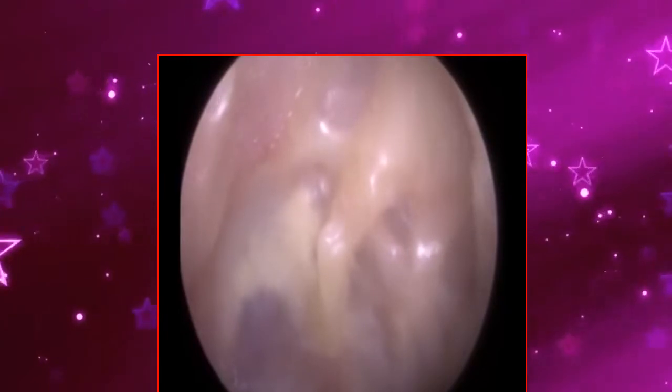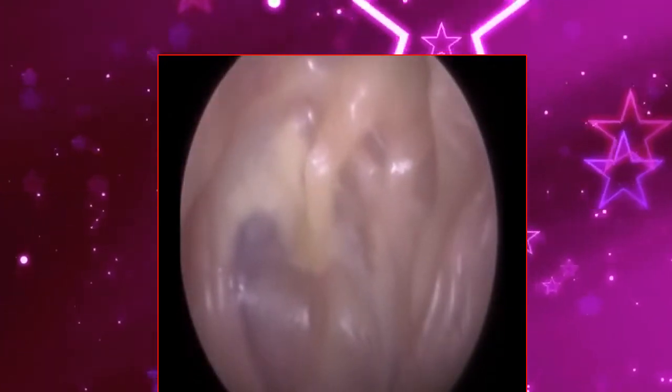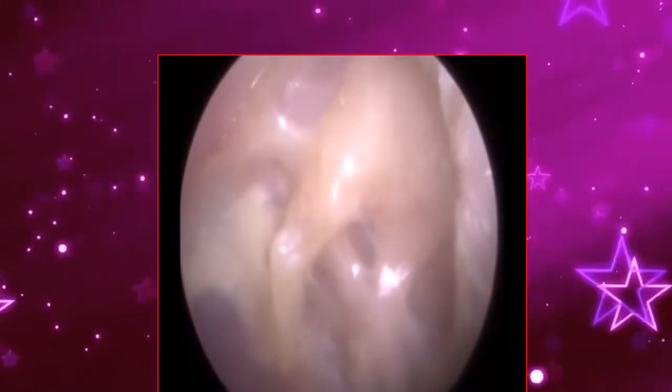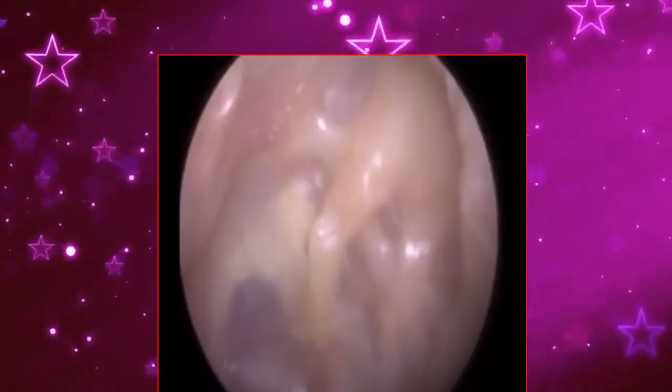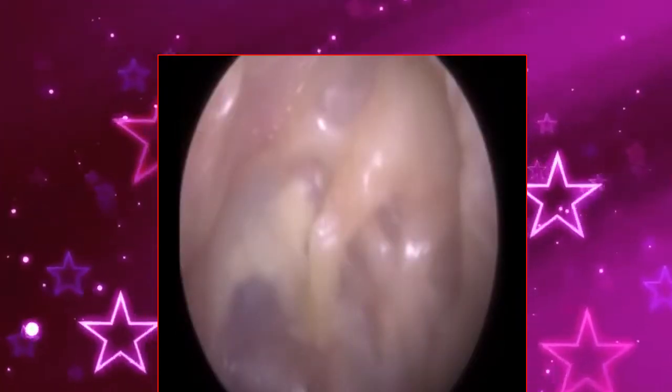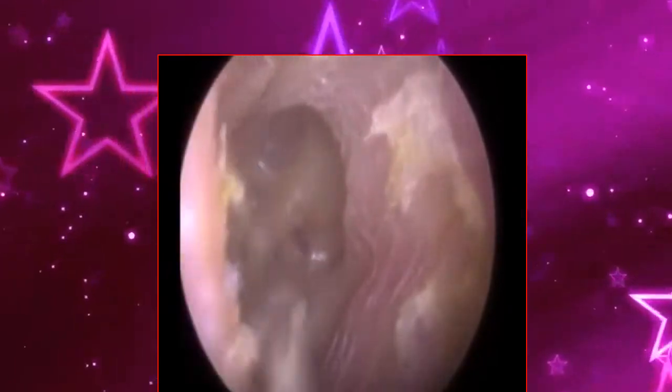But what I've actually used here is my iClearScope. The iClearScope is fantastic for videos, but it doesn't really give great still images. Decent enough, but so that image there, in a moment, you will get for those students or anyone else that's interested. And here's a quick still image, but later on at the end of the video, I have annotated it, I've labelled it.